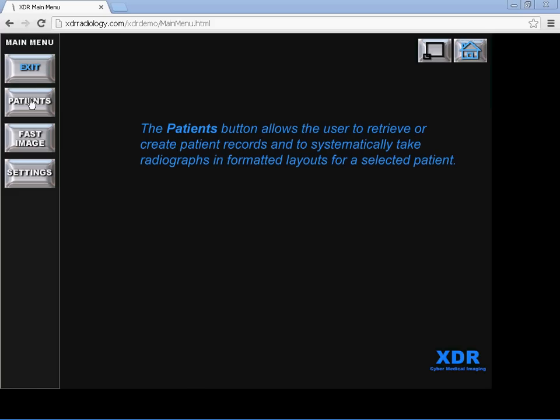There's the Patients button which allows the user to retrieve or create patient records and to systematically take radiographs in formatted layouts for a selected patient.